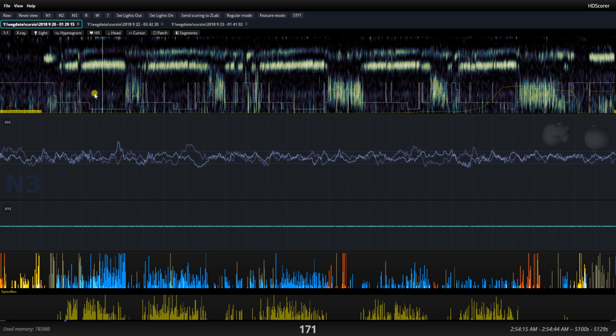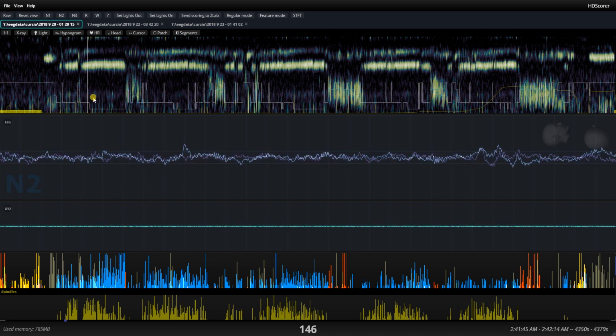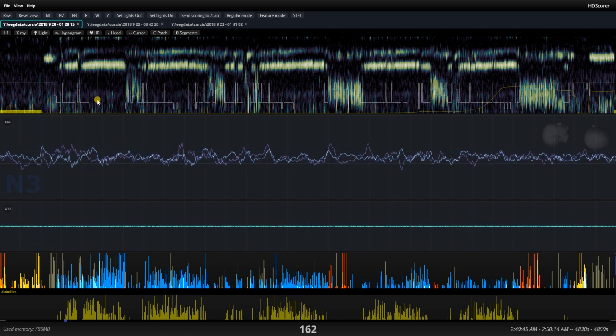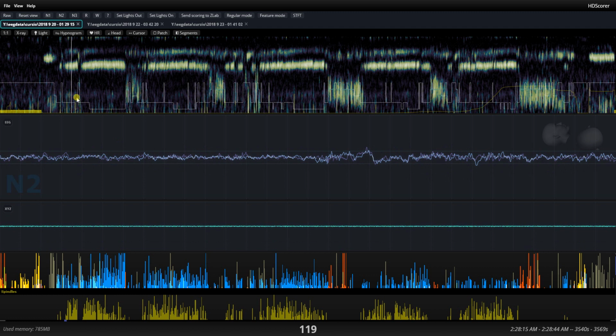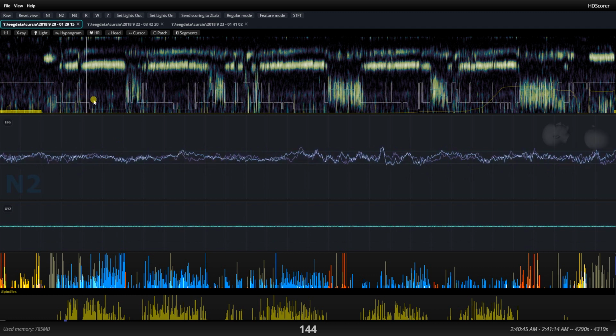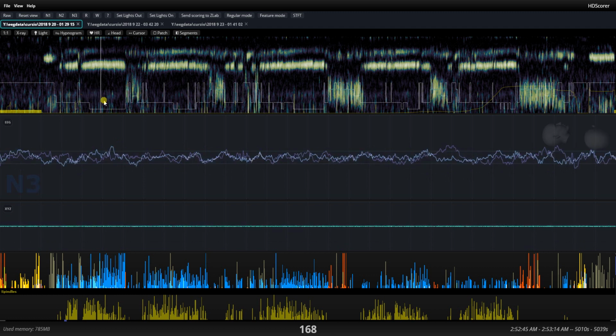Then the next thing I do is go to the transition phase, that is when N2 turns into N3, and see if there's a difference here. And yes, I do see some substantial difference between before and after. Hope you can see it as well. So here's how I validate that the transition between N2 and N3 got picked up correctly. Then if you want to be even more certain, you can move to other sleep cycles.